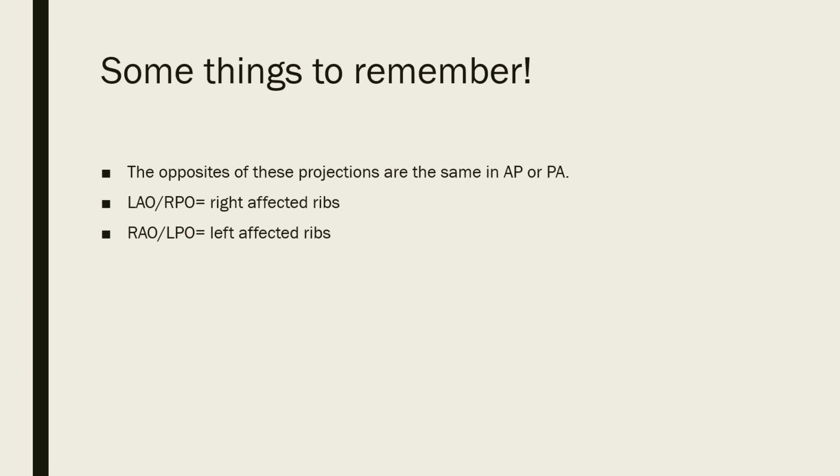Some things to remember. The opposites of these projections are the same in AP or PA. It is very important that you listen to your text during clinic so that whenever you begin working, you know all the little tips and tricks to help make you a great tech.